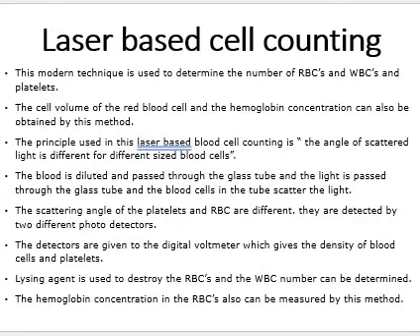The scattering angles of platelets and RBCs are counted, because WBC does not have any definite shape, whereas RBC and platelets have a proper shape. Therefore, they deflect the laser light at a particular angle. There are two detectors utilized: one to detect the RBC and another to detect the platelets.